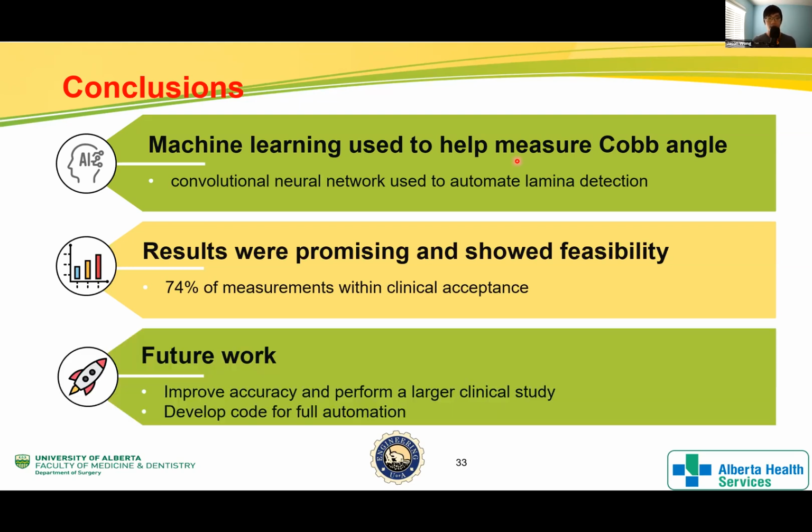And in terms of future work, we hope to improve the accuracy and also perform a larger clinical study to further validate the results, and also to develop code for full automation to make ultrasound more commonplace in scoliosis clinics.